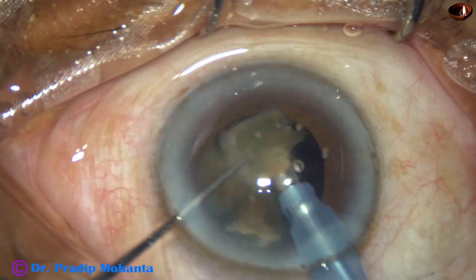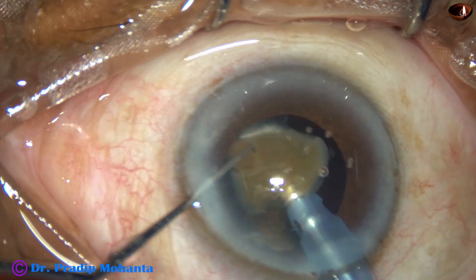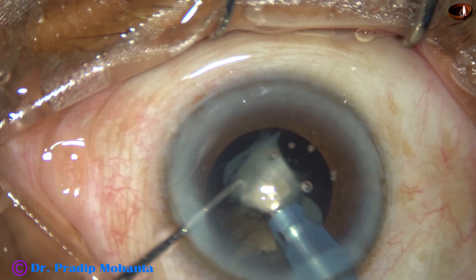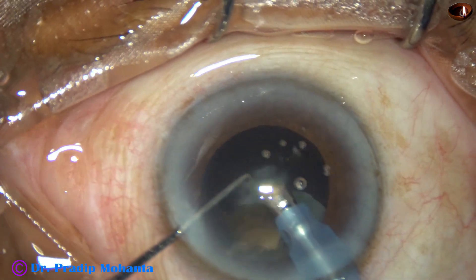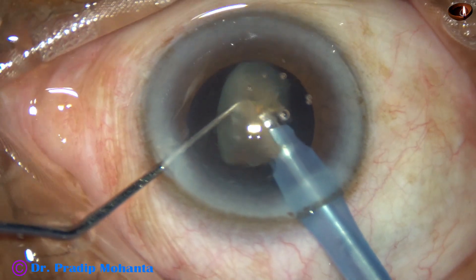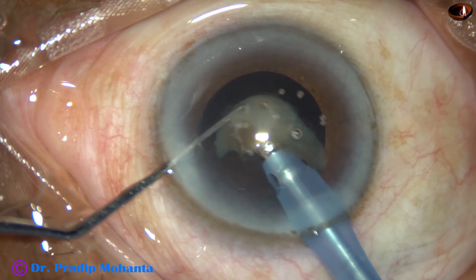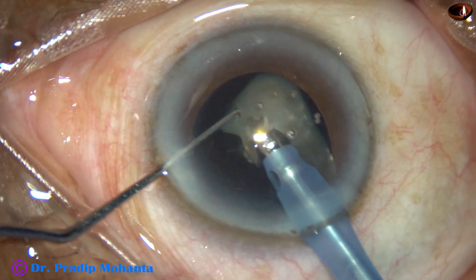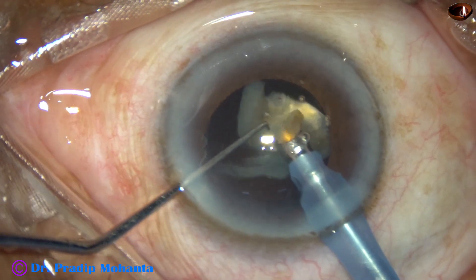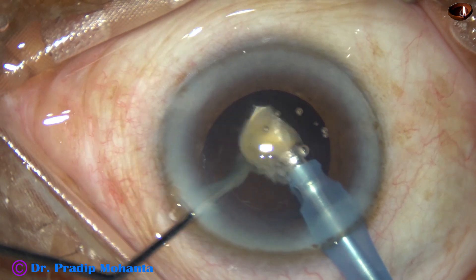The ultrasonic energy used in this case is 85%, flow rate is 40 ml per minute, and vacuum is 400 mmHg. For the last nuclear piece, I use phaco mode 3, where the vacuum is 250 mmHg and flow rate is 25 ml per minute.